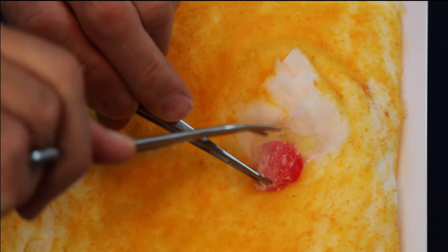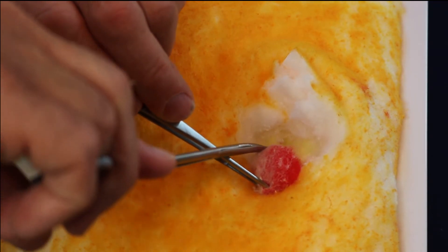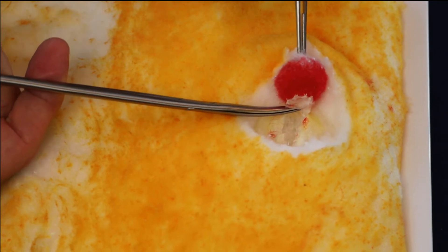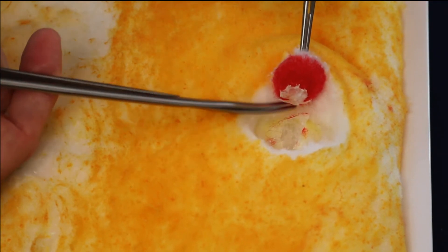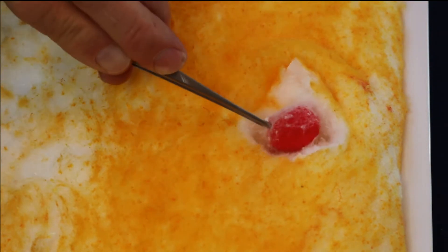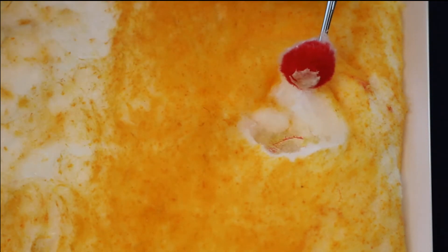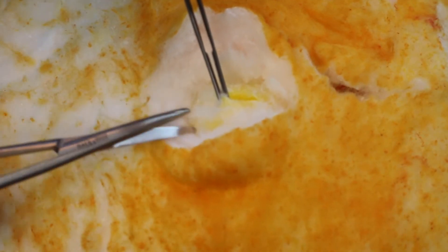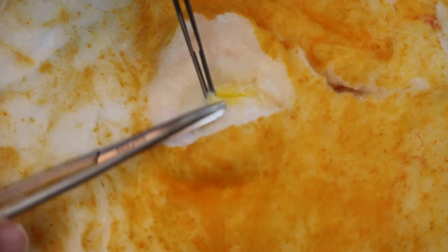As the lump is being excised, as noted previously, you may have to gently push the surrounding tissues out of the way. Once the tumor has been excised, proceed on to another utilizing the same technique.